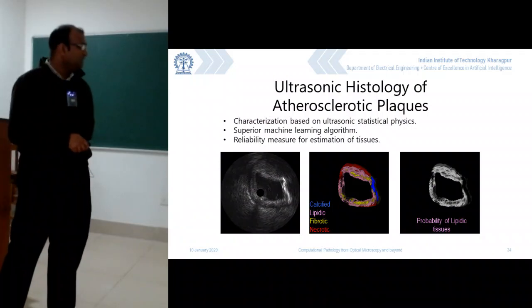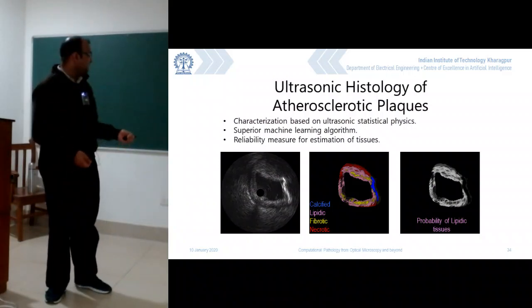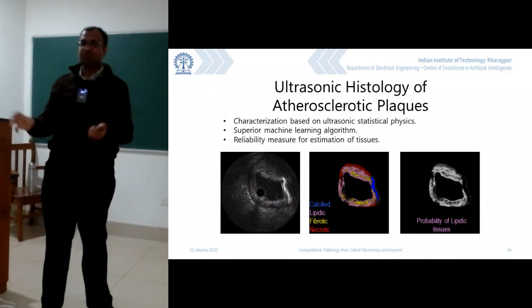Now by way of this, what we could design is ultrasound machines. Typically in an ultrasound machine you see a bunch of speckles like this which are very hazy in nature, but now you can tune over there. You can select one particular tissue, say I want to look only at fibrotic tissue. It will show you only speckles corresponding to that. It will not show you anything else.